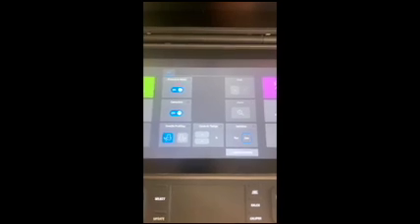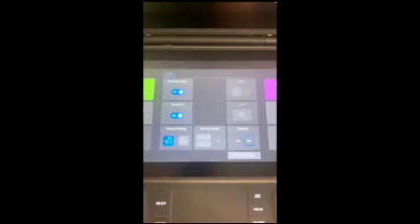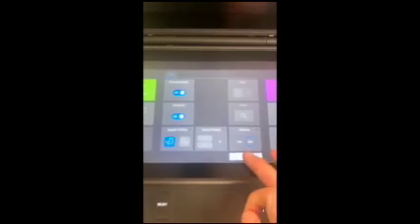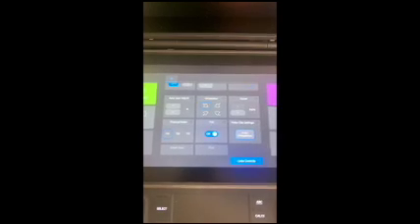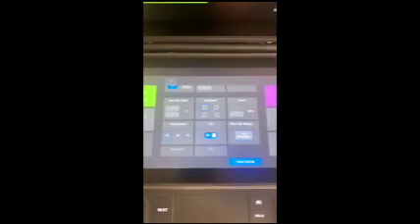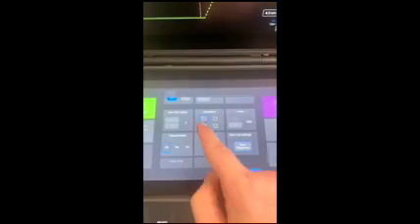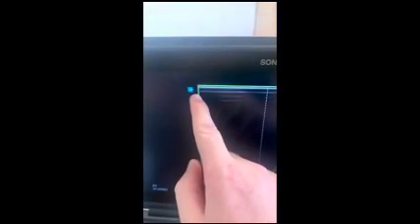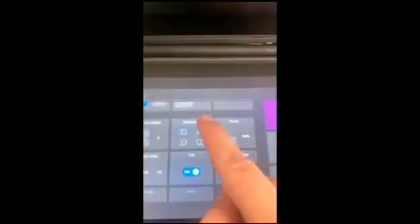There are a couple more controls that might be useful for you. If you click here, you can access them. The main things would be orientation, which you can see here. If you want to flip the orientation marker on the screen, you can do so with these buttons. Now the image is flipped, and the orientation marker is on this side.